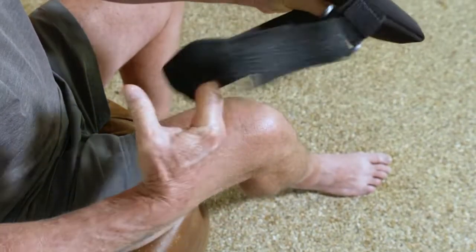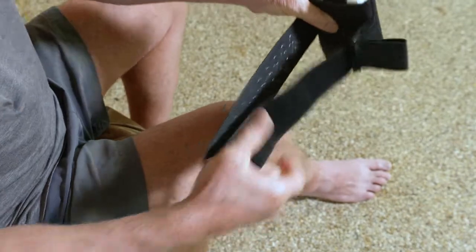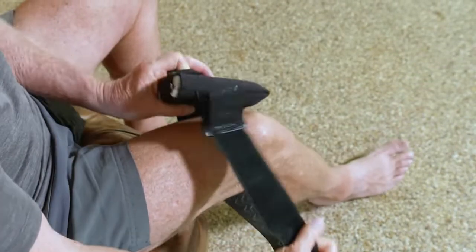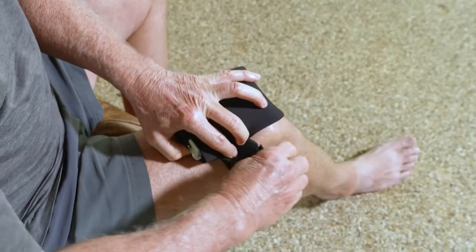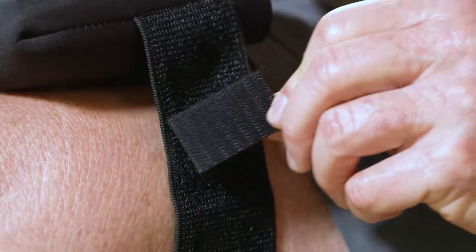To wear the case on your leg, loosen the strap and slide your foot through the loop with the silicone waves facing towards your leg. Keep the device oriented for access to the port on top. There is a removable piece of velcro which can be moved where necessary to ensure proper fit.